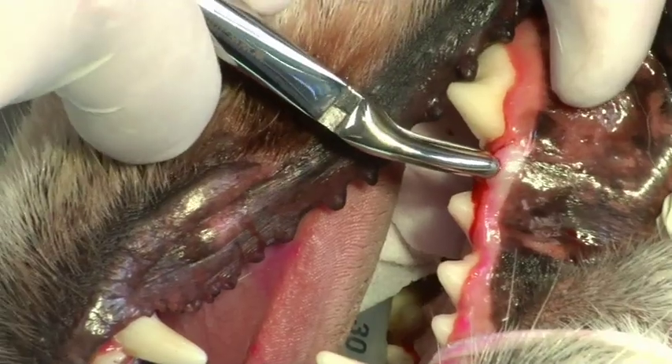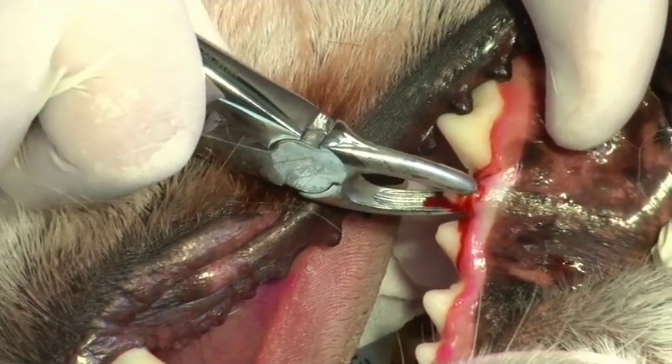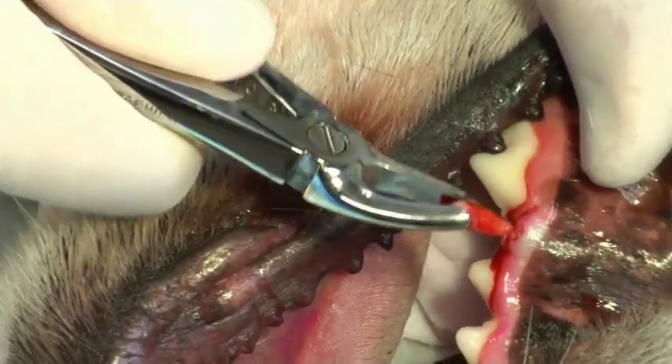Once the tooth is loose, extraction forceps can be applied. The premolar tooth root is conical and will accept rotational movement.